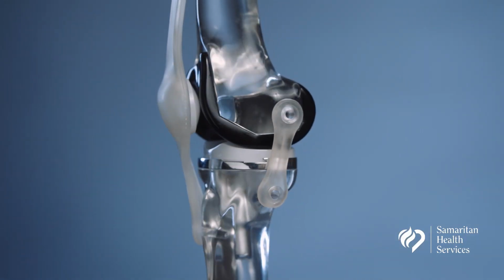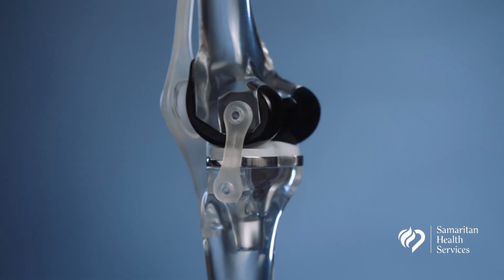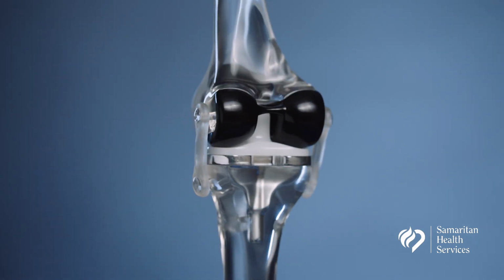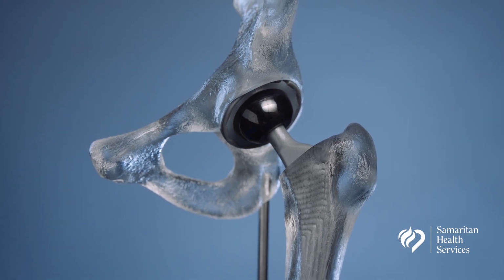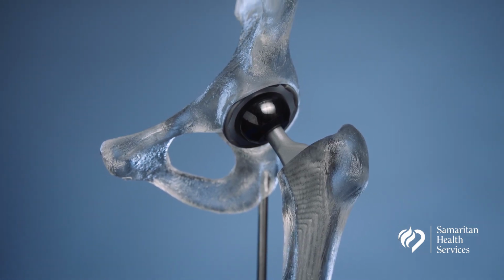Hip and knee replacements are made of two basic materials, metal and plastic. The metals used in joint replacement can be a cobalt and chromium alloy or a titanium alloy, depending on the type of implant used. In my practice, I also use components made of a special metal called oxinium. Oxinium is an oxidized zirconium, which makes for a surface that is extremely smooth. A smooth surface is important, as the metal articulates with or rubs against a plastic spacer.